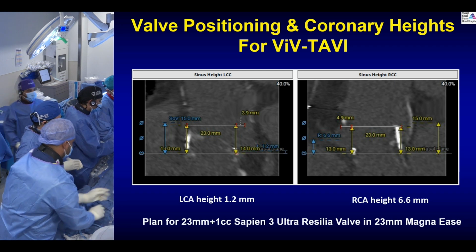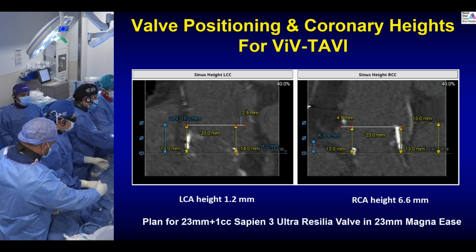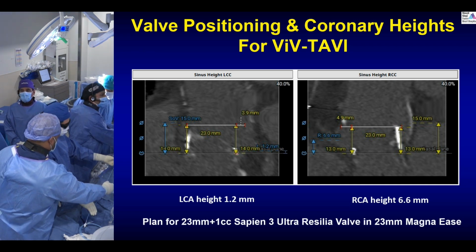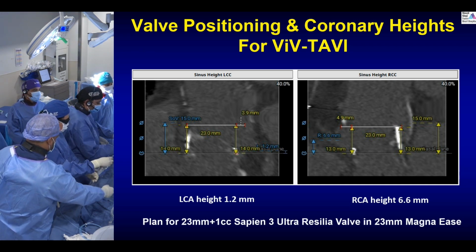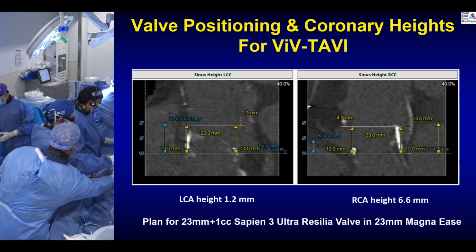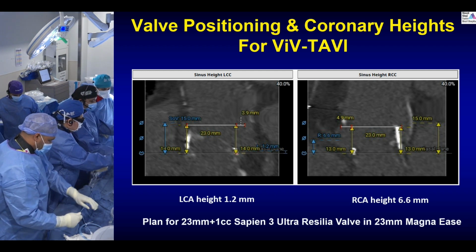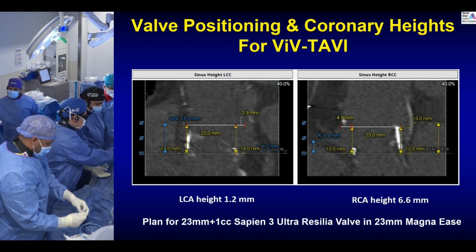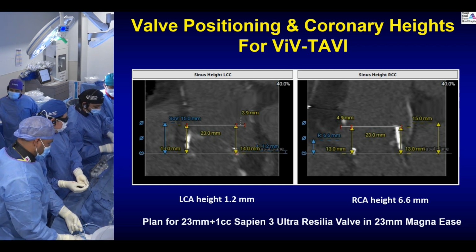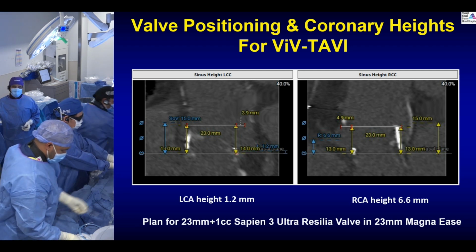Now the question is, will we have the same issue a few years later? 10 years later, maybe we'll have better supraannular valves, Navitor and various types, which will have better coronary access. And Gilbert knows that we can argue against that by saying you could have a faster degeneration of a small valve and a slower degeneration of a supraannular valve, perhaps better durability. The coronaries didn't show any significant coronary stenosis. His likelihood of needing coronary interventions in the near future is minimal.